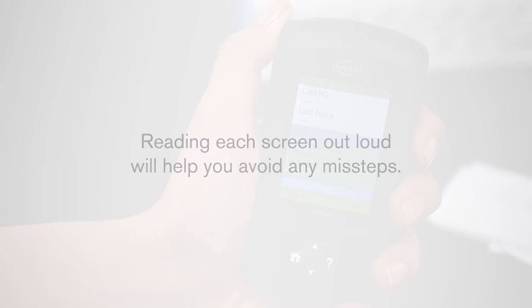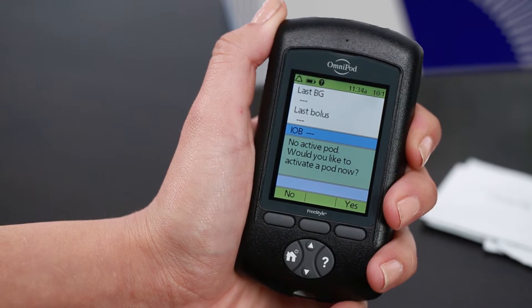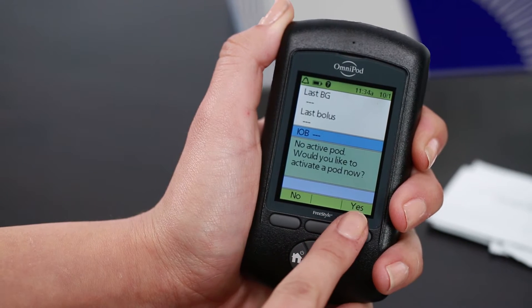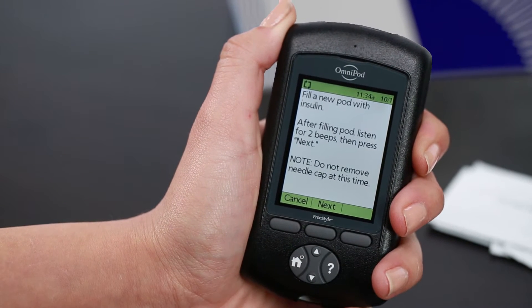The PDM will now display no active pod, would you like to activate a pod now. Once you click yes, the PDM will prompt you to fill a new pod with insulin.